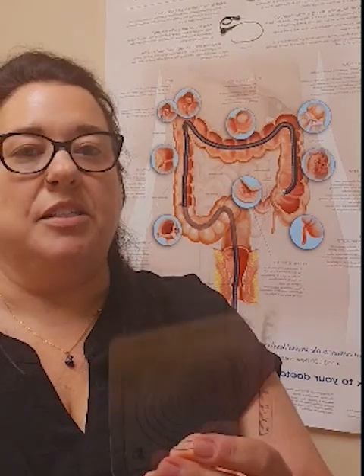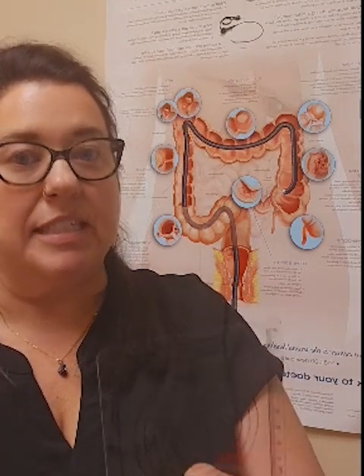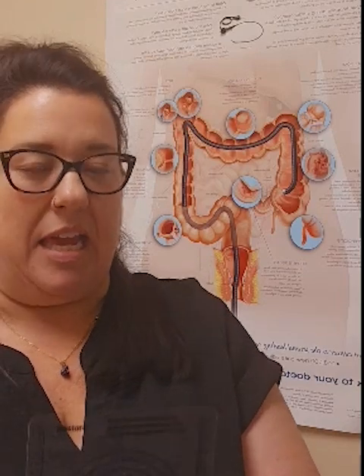So your stoma may start out a little bit larger post-surgery due to some swelling, and then as the days go by and healing is happening, your stoma size should actually get smaller. That stoma should shrink in size and become more of the size that it's going to stay as long as you have it. So you should measure with every appliance change, which is at least every 3 days in the beginning of the healing process post-surgery, and make sure that the stoma size is decreasing. That's what we're looking for.